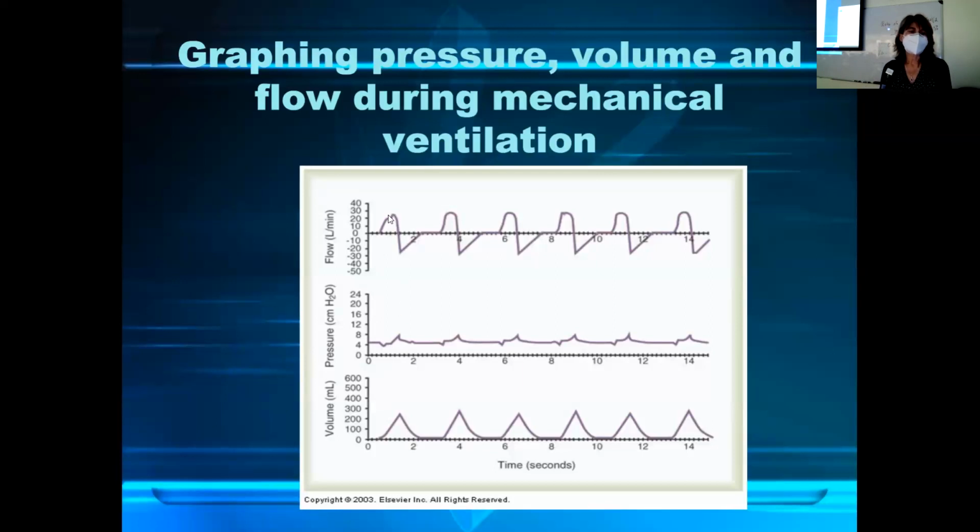So the air is flowing in during this spontaneous breath. And the last one shows the volume that went into the lungs, going all the way up. And then the volume that came back out of the lungs all the way down. So if the person completely exhales, it'll touch the baseline. So air goes in, air comes back out.